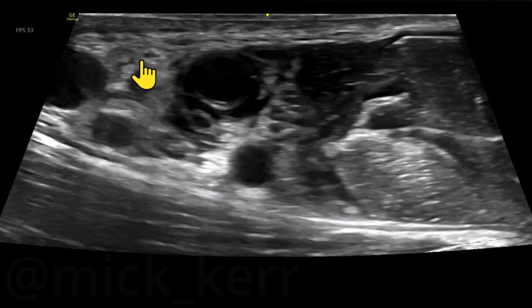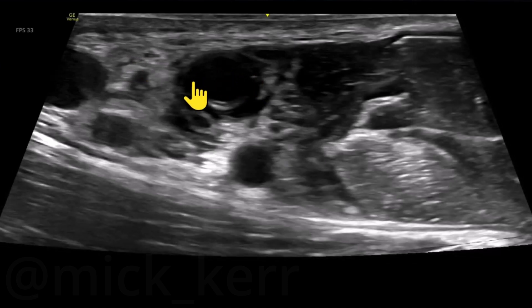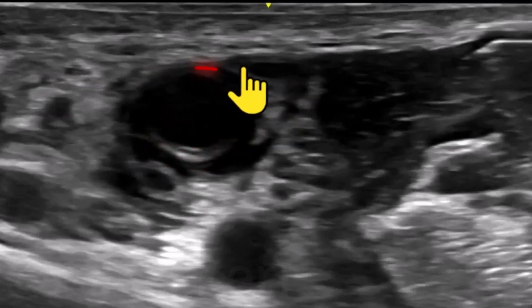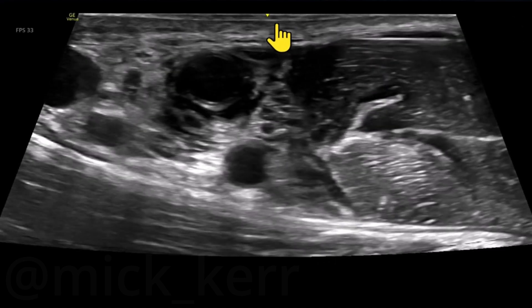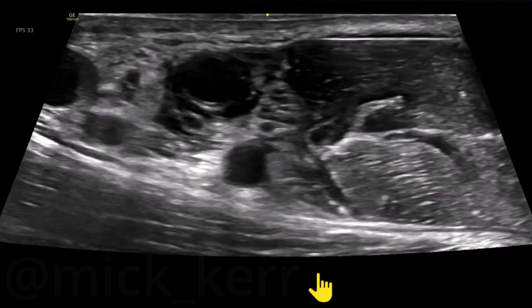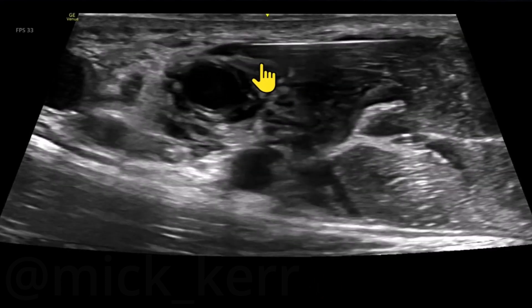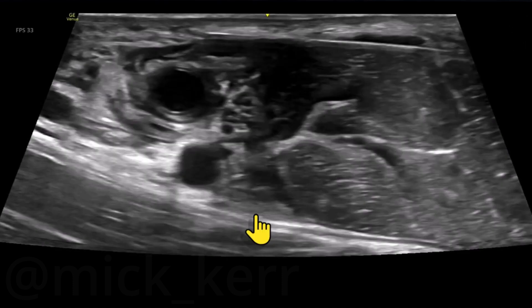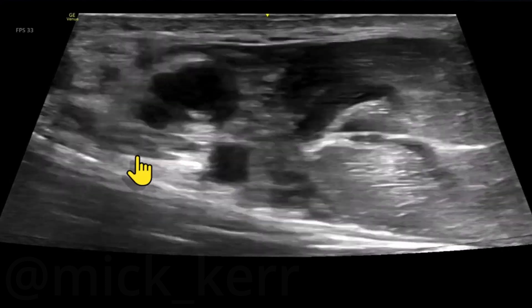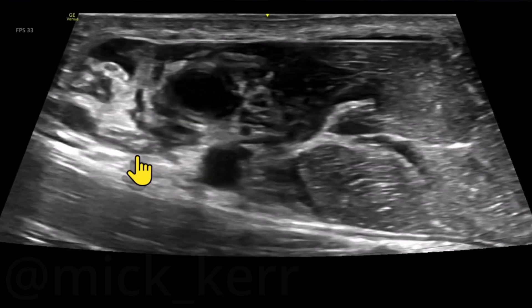Now we're trying to get the medial cutaneous nerve of the forearm, which is somewhere over here — I think it's that one there. Keep in mind we've got an artery here and a vein that is compressed here as well. I'm going to scooch along this fascia and check in for that vein — it's now being pushed down, you can see it here. I'm happy with that, so I'm going to use the local to hydro-dissect the space. Pretty sure this is the nerve I want — it'll pop. And there we go.